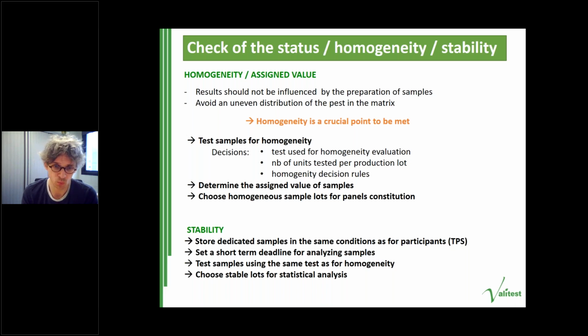And if some of the lots are not as stable as expected, the results associated to these lots should not be taken into account for the statistical analysis.